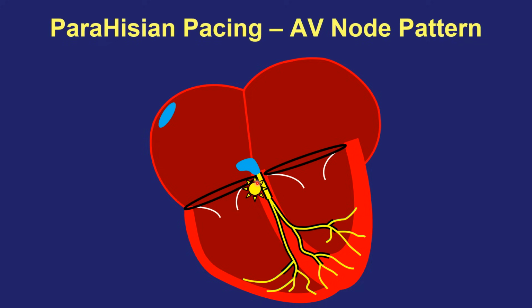How do we get from this pacing stimulus up to the A? Well, we took a shortcut because we directly captured His bundle tissue. So to get up to the atrium, all you have to do is travel retrograde up the remainder of the His bundle through the AV node, which again is sort of slowish conduction, and then into atrial tissue. That's the pattern at high output.